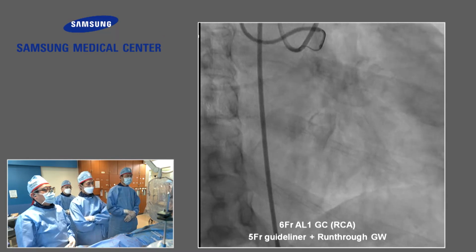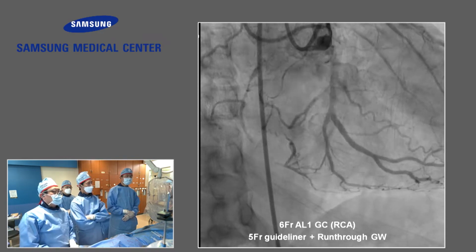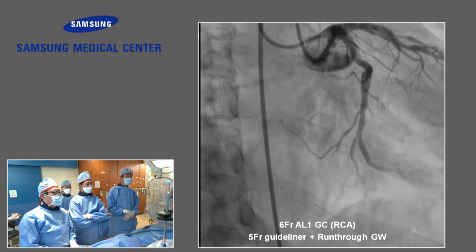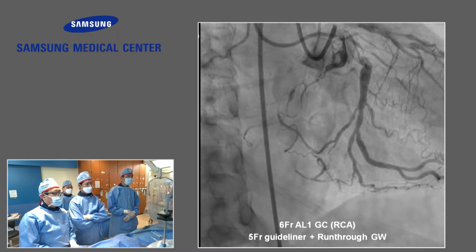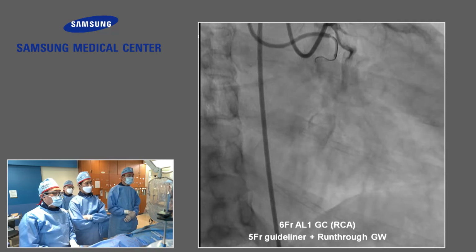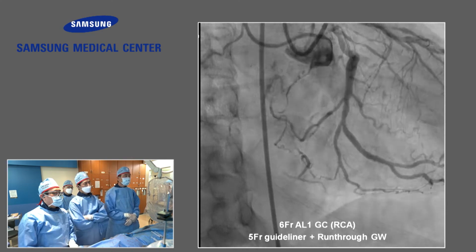How about the opinions from the panels? I also recommend a retrograde approach first because the lesion length is more than 20 and somewhat tortuous.